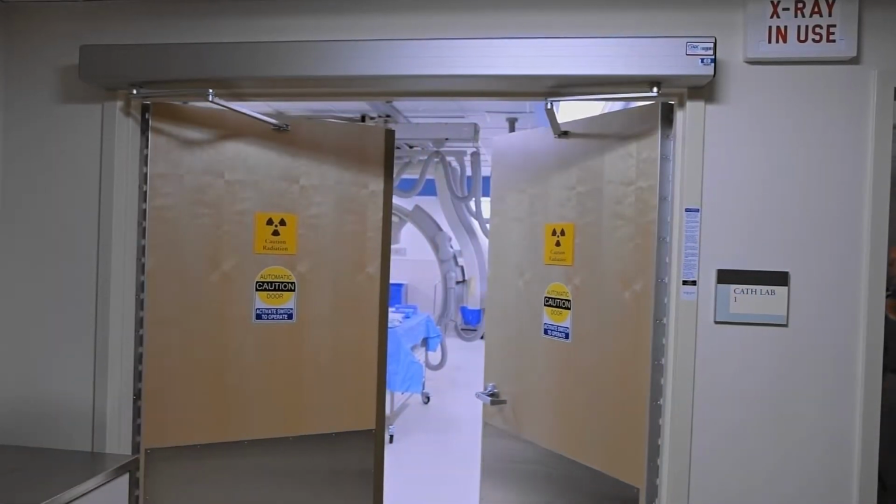Cardiac catheterization is considered the gold standard of investigating patients' coronary arteries. So basically it would tell us whether somebody has any type of blockages in their arteries. Now we have other non-invasive tests which involve stress tests and imaging techniques, but still the best resolution comes from cardiac catheterization.